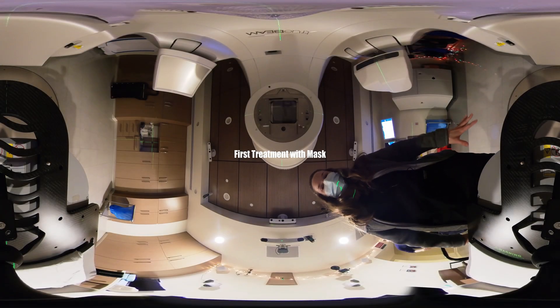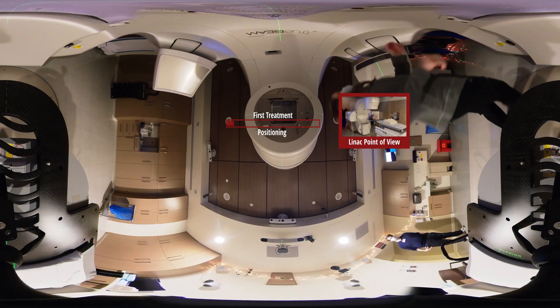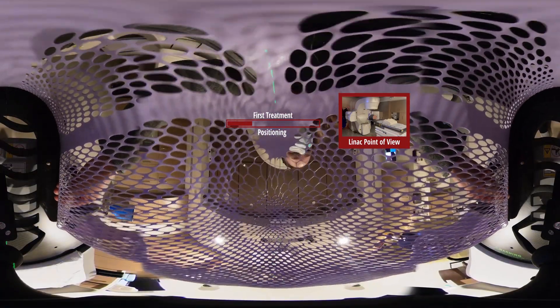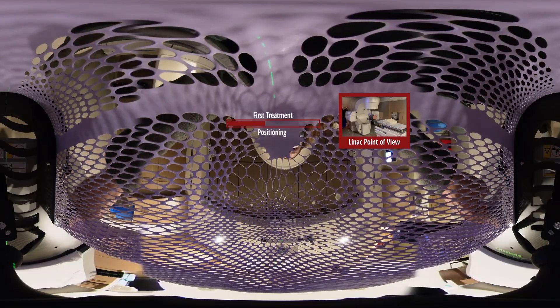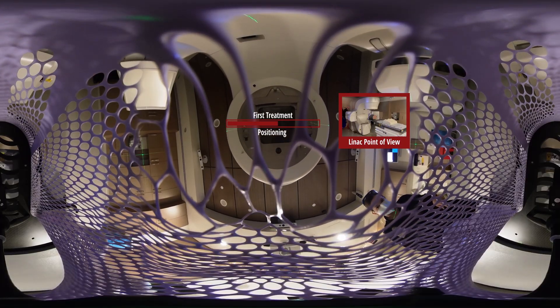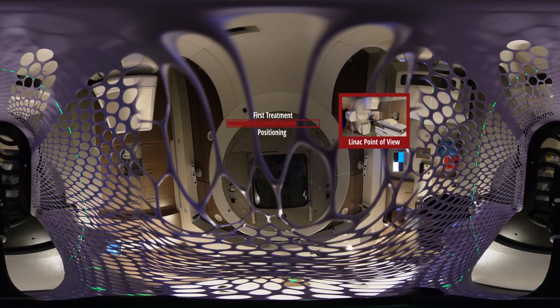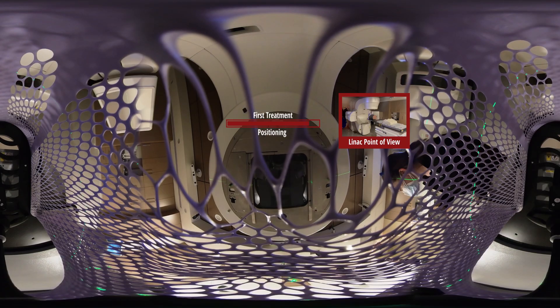So when I start to put the mask on, it might feel a little snug — that means it's doing its job, but you may need to wiggle around a little bit to get that right fit. Here it comes. Just make sure you stay nice and relaxed, just sink into the table. You're doing great. We are all set. We're just going to line you up to those marks that are on your mask. All lined up. We're going to step outside the room and get started. Just remember, if you need us at any time, just go ahead and wave your hands. We'll come right in. Here we go.